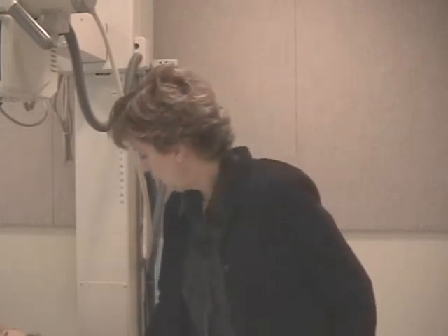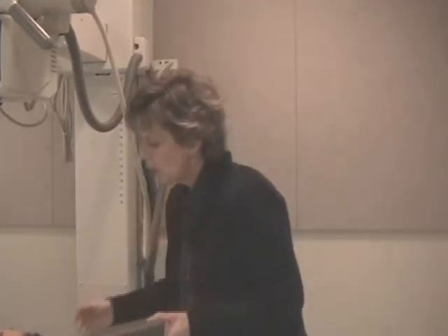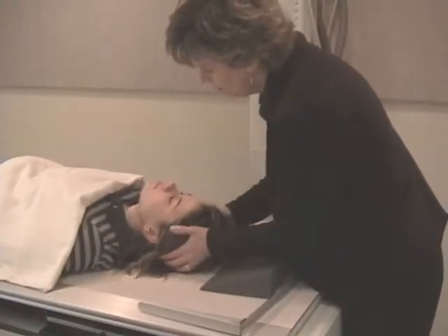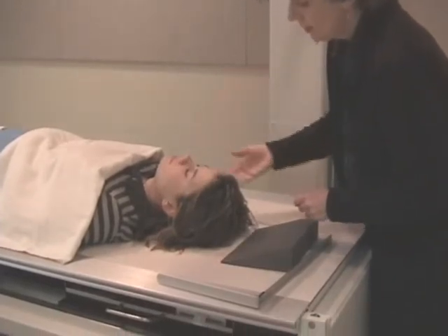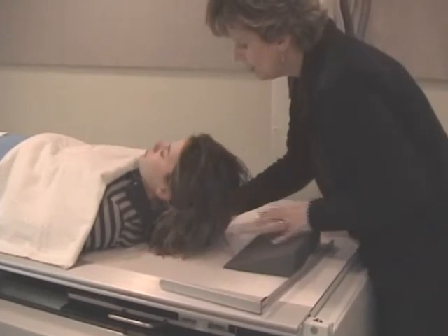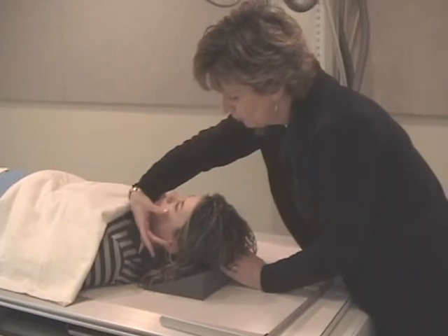There are going to be many times that a patient cannot tuck their chin in order to get the orbital meatal line perpendicular. So I put a trick out here for you. I have a positioning sponge, and we're going to try to mock it with Drea. She's fairly flexible, but it's hard to hold, so we're just going to let her offset her orbital meatal line and pretend she can't tuck her chin anymore, and you can see how it's not perpendicular. Let's say she can't tuck her chin anymore. Well, I'm going to raise her skull up and put a sponge in and see how that adjusts the orbital meatal line.